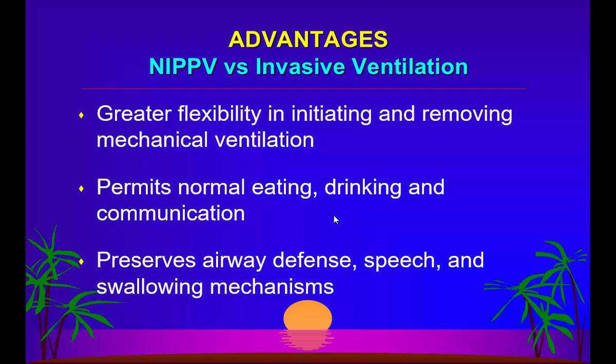One thing is very important: when the mask is on, please do not do it, because there is a very high risk of aspiration. Or if the patient is speaking, it can cause air leak, and then this can cause discomfort and inadequate ventilation. So if somebody is to eat or drink or talk, it is very important that you remove the mask, remove the ventilator, and then you can allow him to do those things.